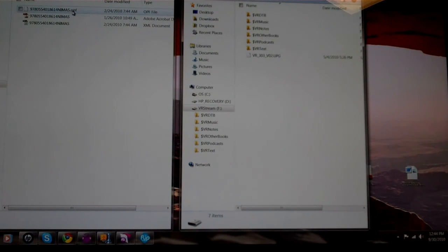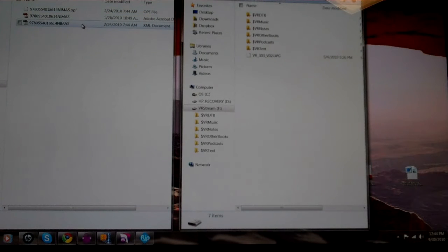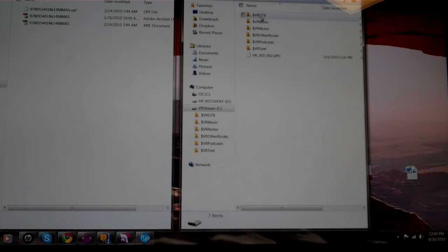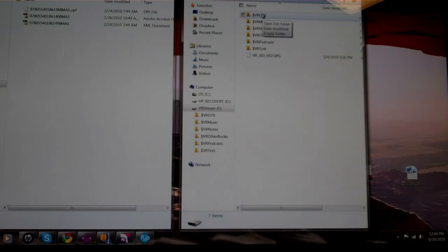Then the two files that are necessary are the OPF file and the XML file. We're going to put those two files into the VRDTB, which is the Digital Talking Books folder.